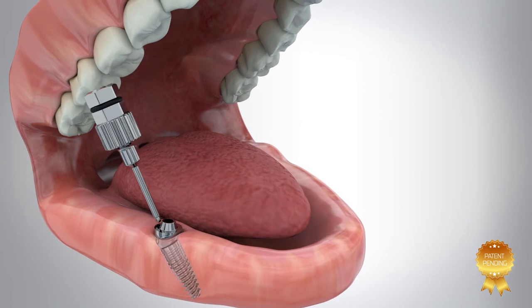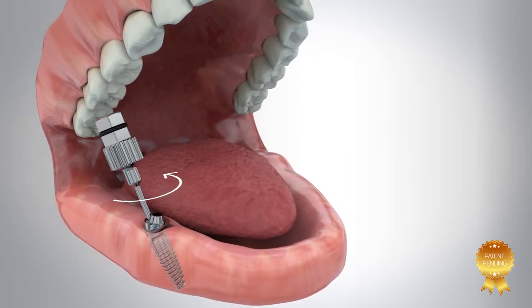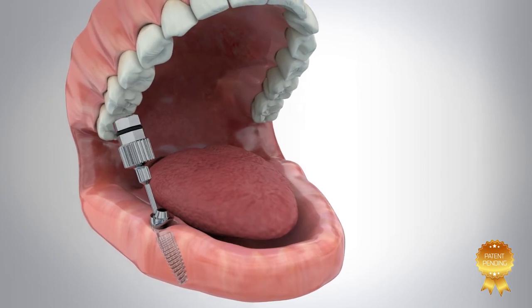In cases where a screw replacement is required due to maintenance or breakage, detachment of the abutment is done using the angulated multi-unit key.